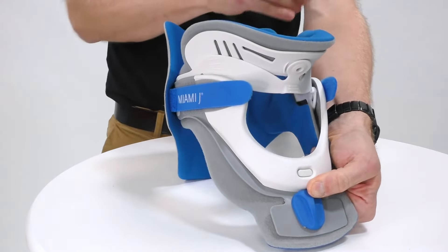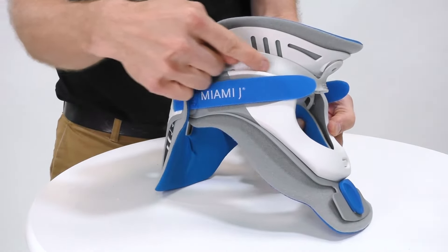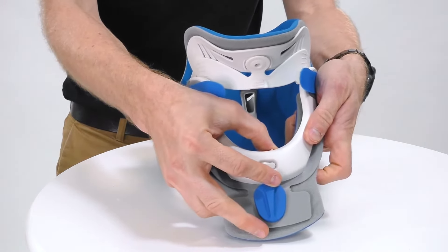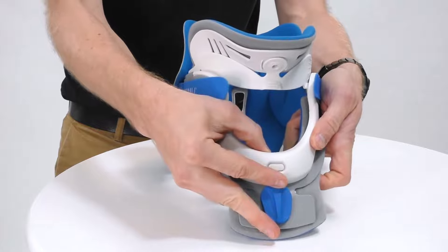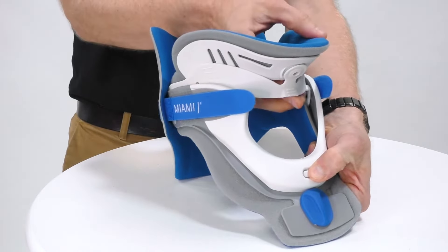As I release this it locks and holds in position, and we can also take note of the height it's set at on the lateral side. There is an anti-tamper locking lever and we push this left to lock, which prevents the button from being depressed and the height adjusted.